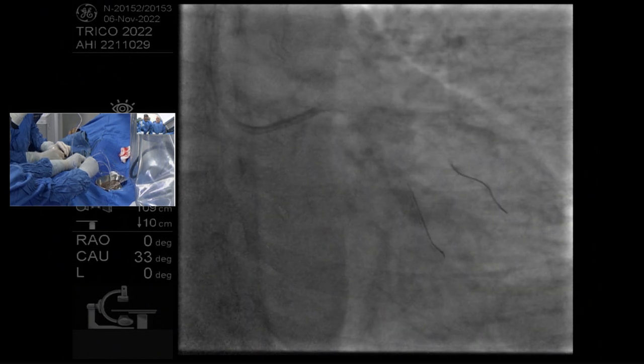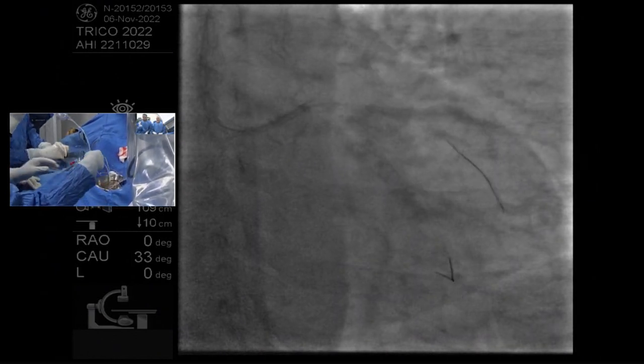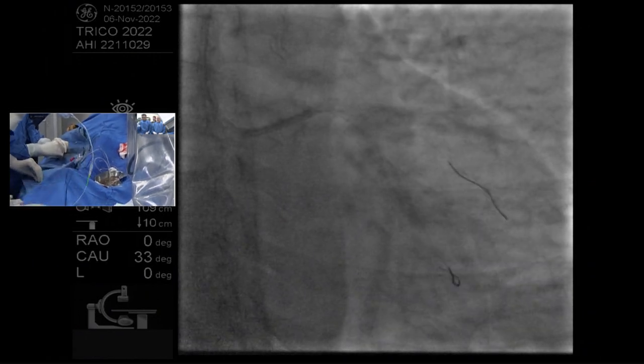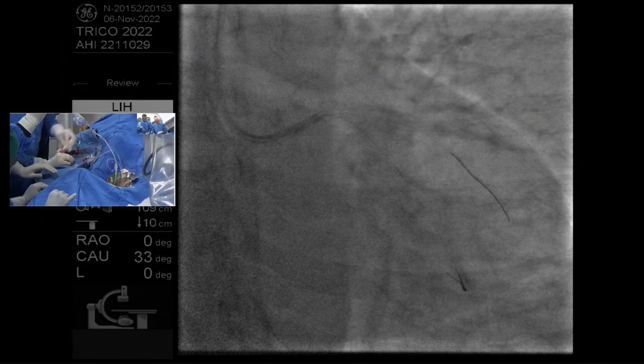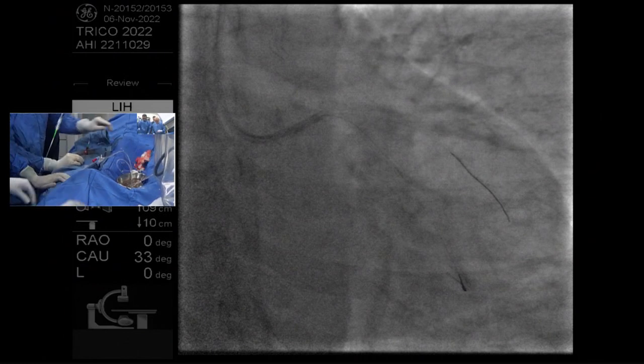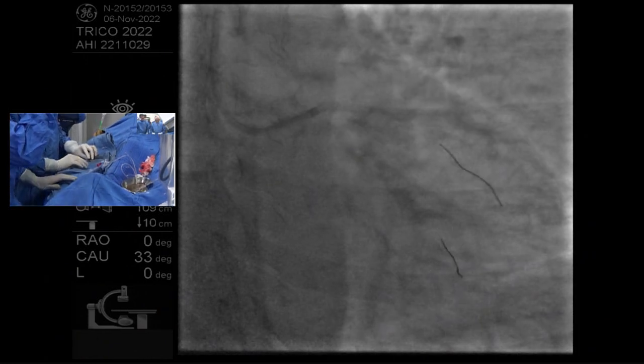So again, I would bury your wire a little bit. You don't want to risk that coming back. There we go. And let's keep that where it is. And now with the balloon going in, you tell us when you start to feel the tactile feedback. And when you do, we'll cine that, because that'll give you a rough idea of where the proximal edge of the tightest point of the vessel is.